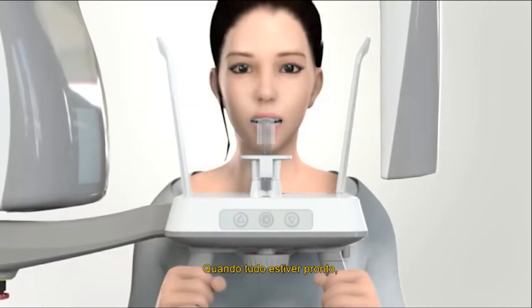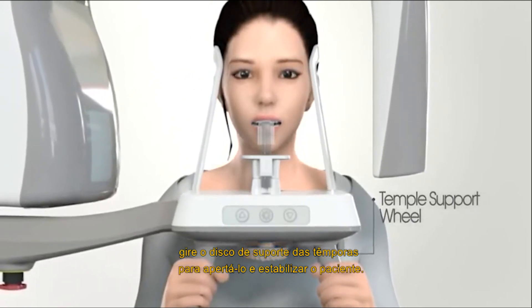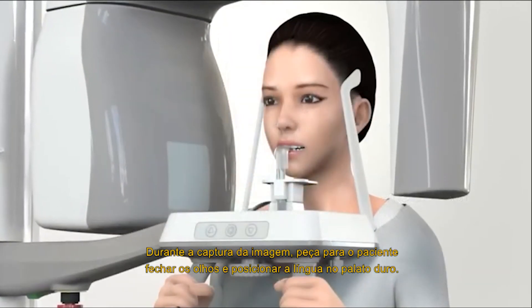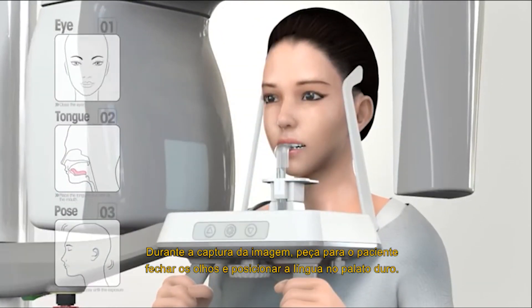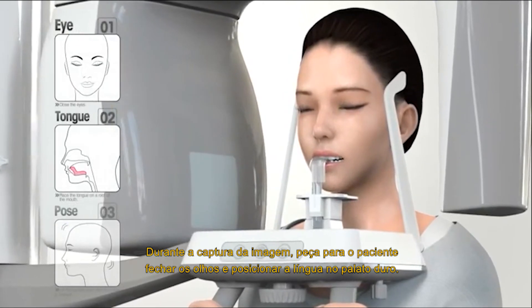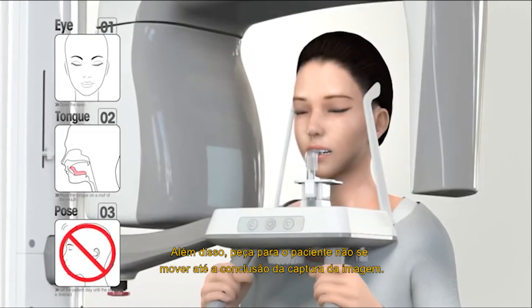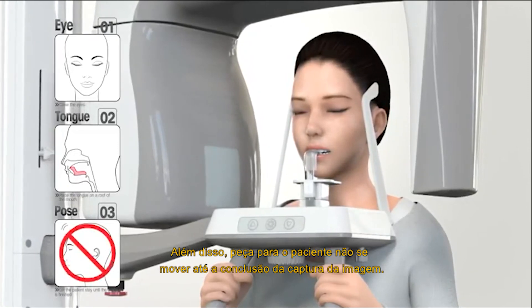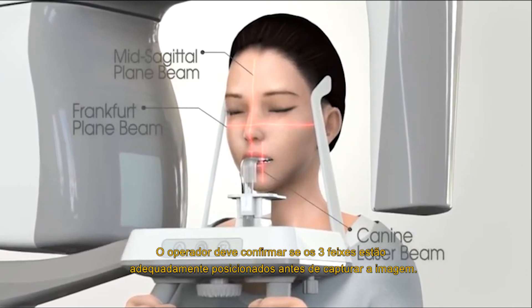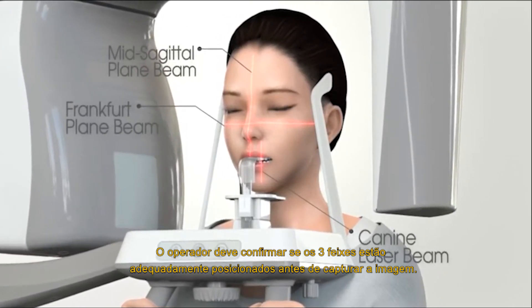When everything is ready, rotate the temple support wheel to tighten the temple support and stabilize the patient. During image capturing, ask the patient to close their eyes and place the tongue to the hard palate. Also, instruct the patient not to move until the image capturing is completed. The operator should confirm that the three beams are placed appropriately before capturing the image.